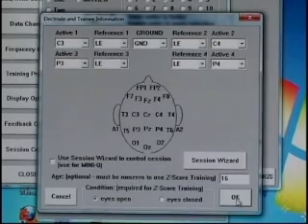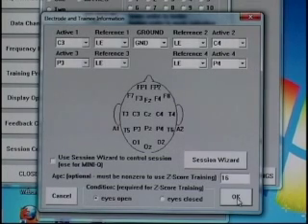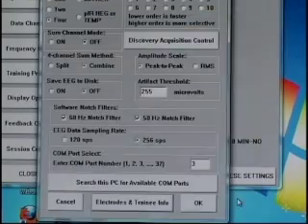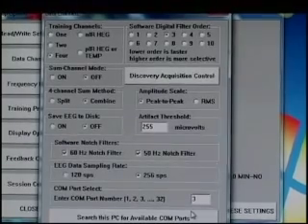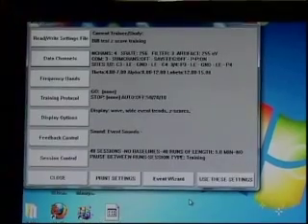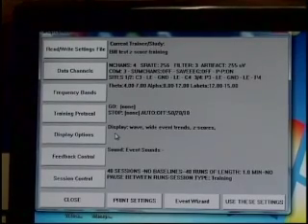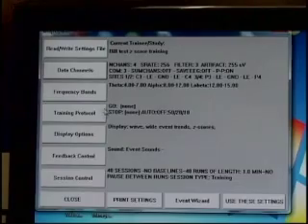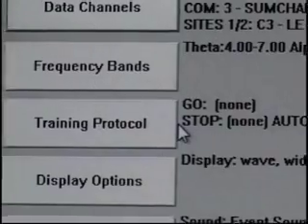After we've made our decisions, we always go to the next step with OK. If we hit the red X in the upper right-hand corner, whatever changes we made do not save, so we tend to want to use the OK button. I click OK and it takes me back to our setup options. As I go down the list, everything is pretty much what I want it to be. We have no goes or stops within the training protocol because the Z-score protocol is all based from the event wizard.